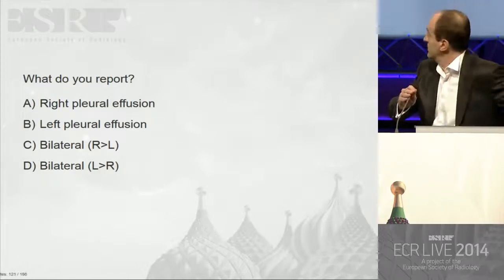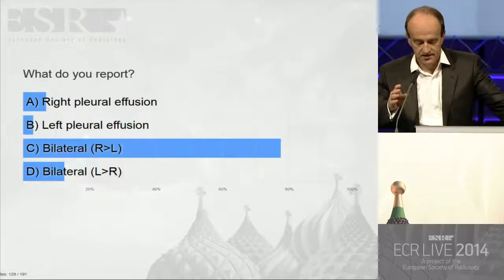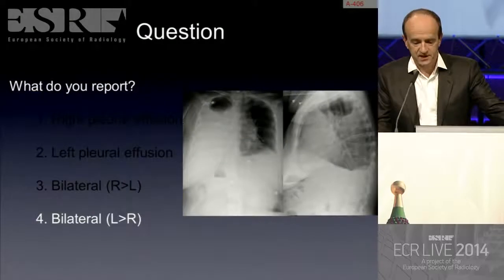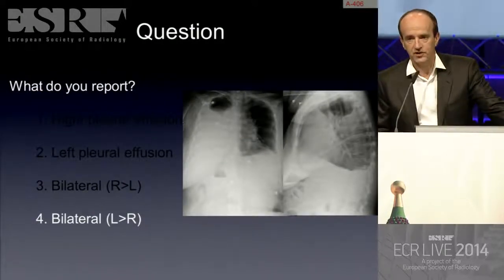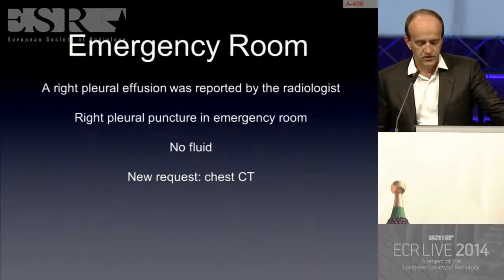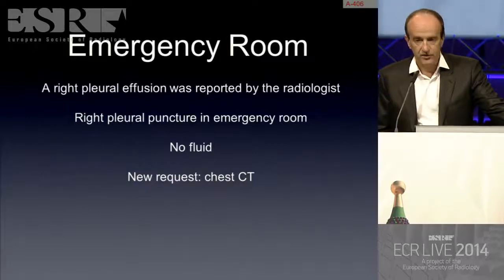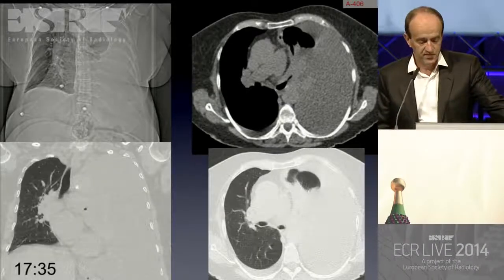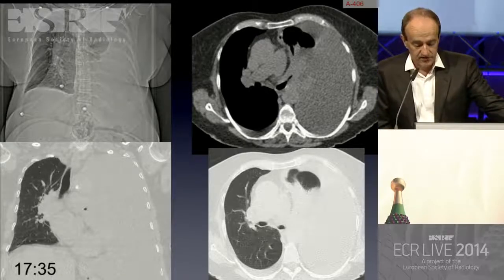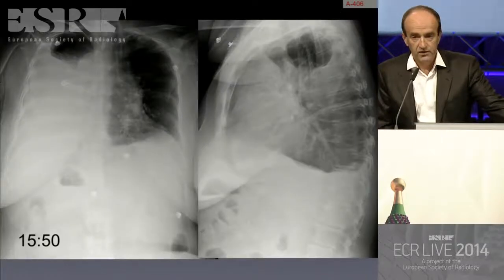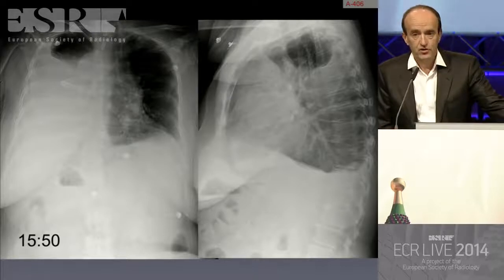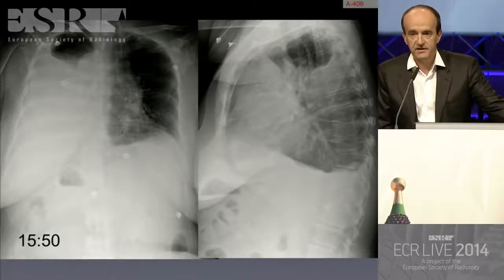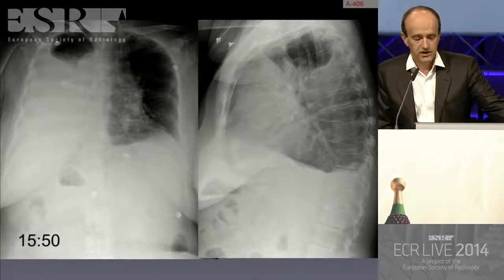The majority voted bilateral right larger than left — but you missed something. In fact, the left effusion is larger than the right. The right pleural effusion was reported as being larger. A puncture was performed in the emergency room and they got no fluid, so they requested a CT. On CT you can see the larger effusion is on the left. Looking at the radiographs again — you should look at the aortic arch and the air bubble in the stomach to detect that this was an error from the radiographer: the radiograph was inverted.